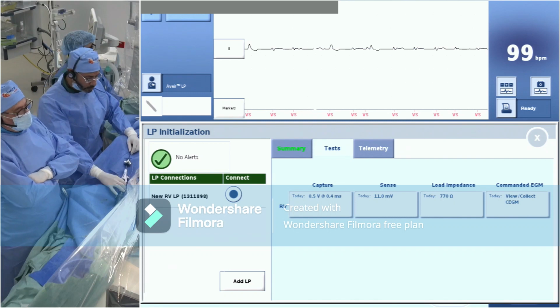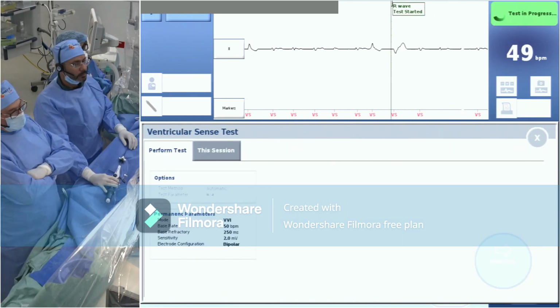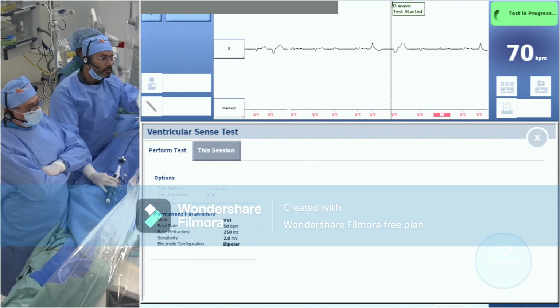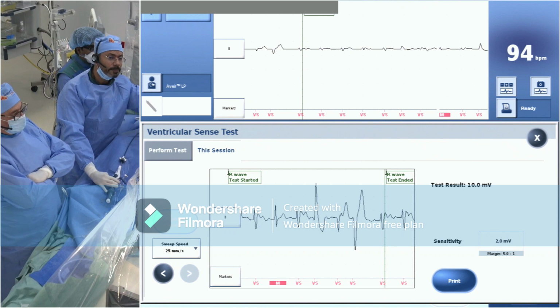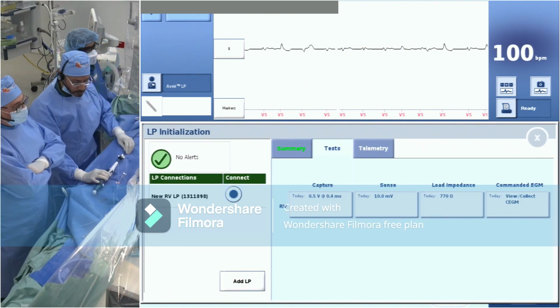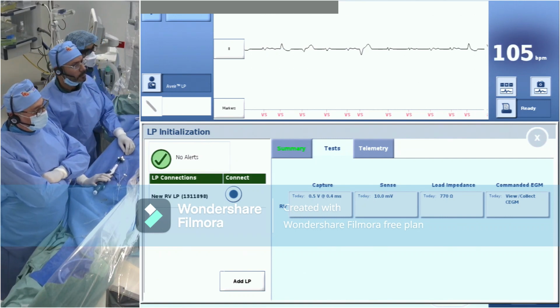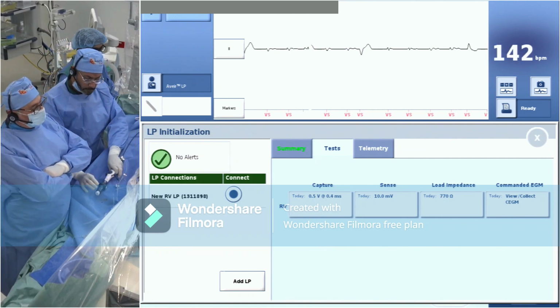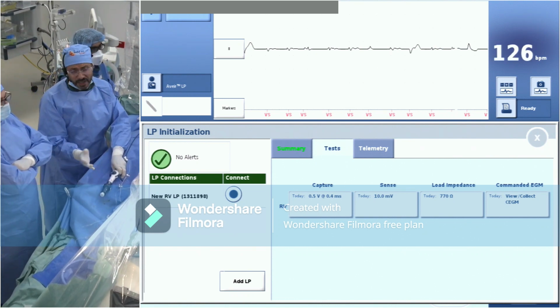No, for the PVC, I agree with Dr. Magdy. It's rare that you'll see PVCs after the placement of the device. You may get something during, but after we have not seen that. The other thing, we have put an AVEIR in a patient who already had a lead in the ventricle. Most of my leads go in the higher septum, so that was not a problem. We put the AVEIR in the low septum. Updating you, we have excellent parameters.